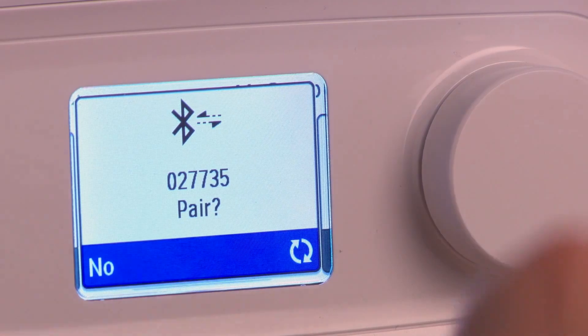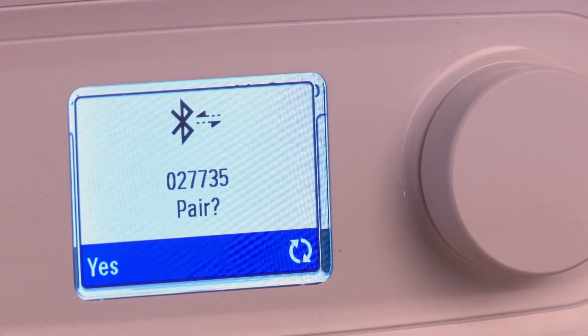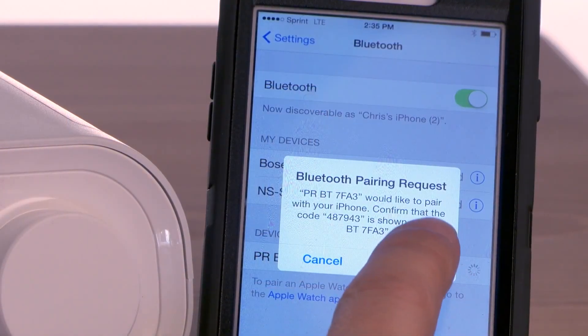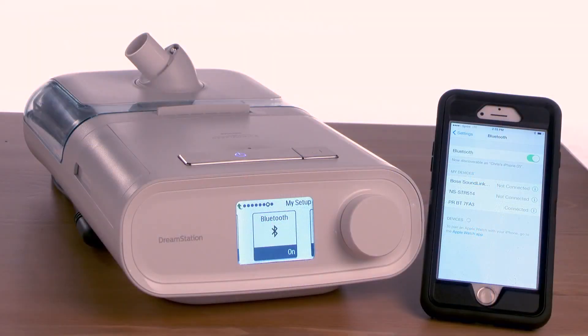Next, return to your device. Your DreamStation will ask if you would like to pair. Turn the knob to Yes and press to confirm. Then tap Pair on your mobile device. A connected message lets you know that your mobile device and DreamStation are now paired together.